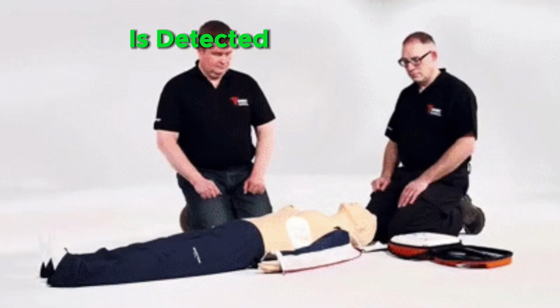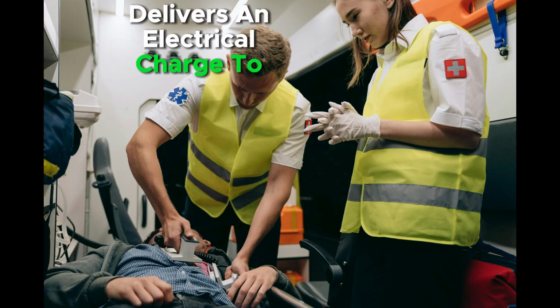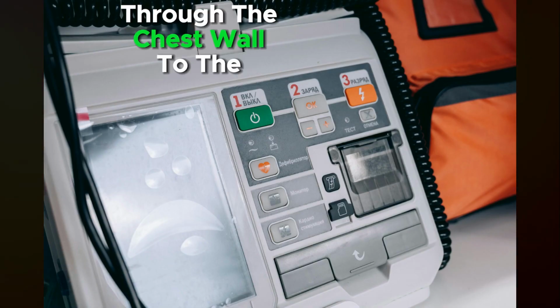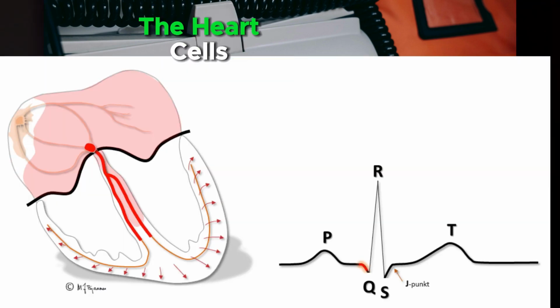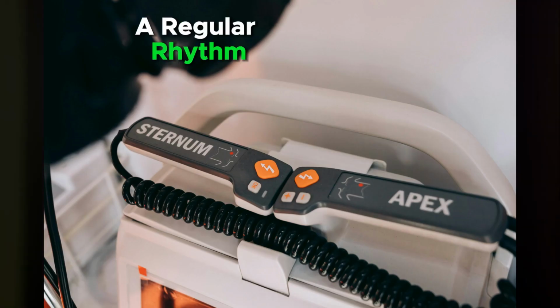When a shockable rhythm is detected, the defibrillator delivers an electrical charge to the heart. The electrical energy is transmitted through the chest wall to the heart muscle, with the aim of depolarizing the heart cells and allowing the natural pacemaker to re-establish a regular rhythm.